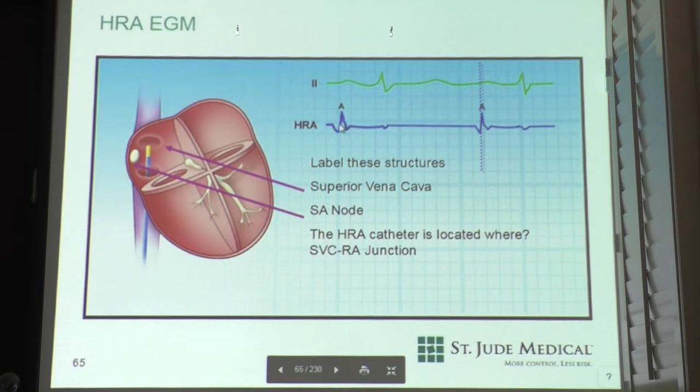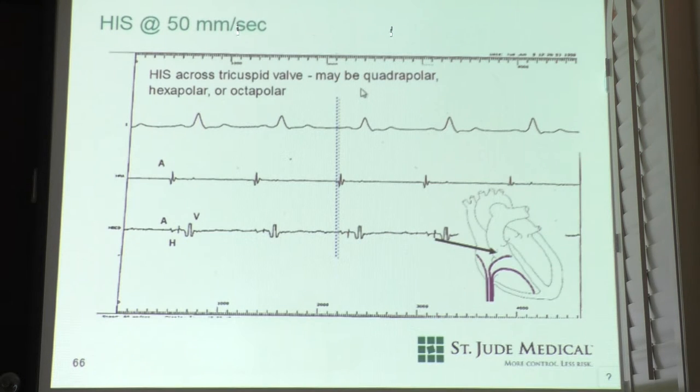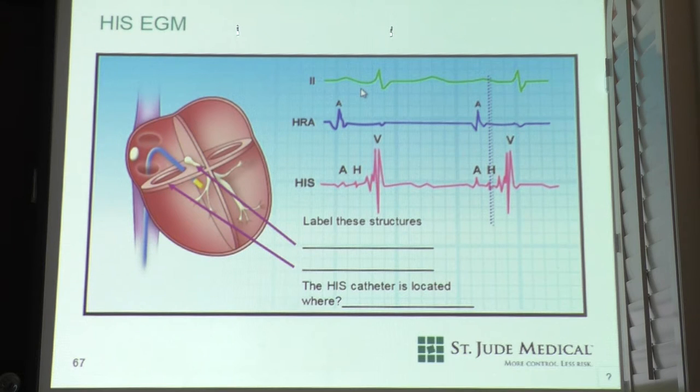A little over to the right? It would go much more to the right. It would be at the end of the P wave. Right, because that's the last part of the atrium, whatever the last atrial tissue is. That's going to be your end of your P wave. So if it's sinus rhythm, right to left, it goes down.